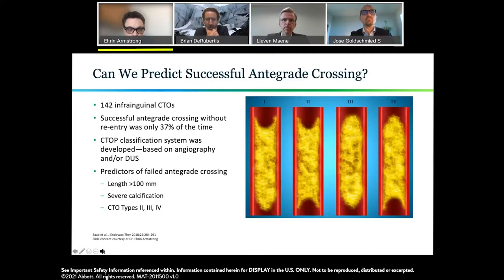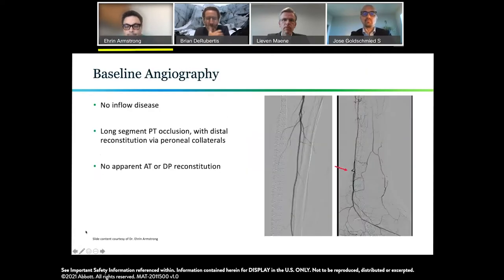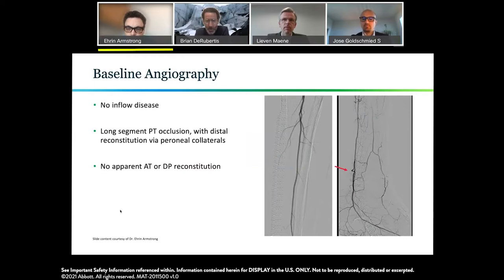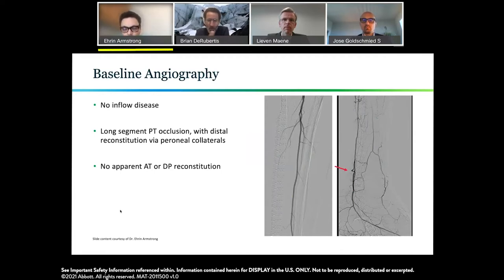This is a pretty typical pattern where when you get tibial disease of the AT and PT, the peroneal becomes the lifeline and reconstitutes one of the two. Do you have comments on an angiosomal-based approach, or do you go for that healthy-looking PT, or consider putting a wire down in the DP to fish around for a hibernating vessel? What's your thought process when approaching something like this based on the wound and anatomy?